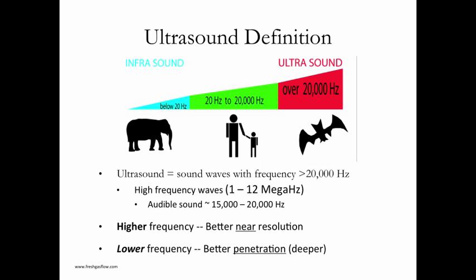Okay, so ultrasound is exactly that. These are very high frequency sound waves, which are higher than the frequency which the human ear can really hear, which is why you don't hear them as you're putting the probe onto the patient.